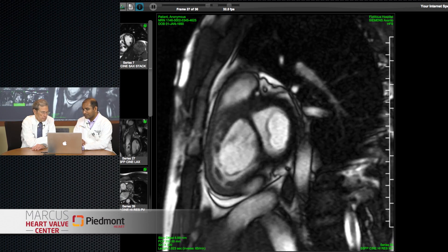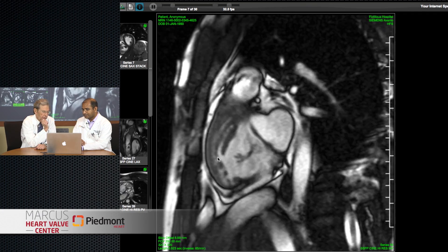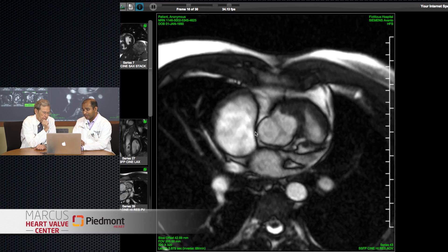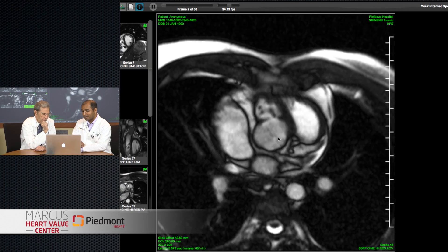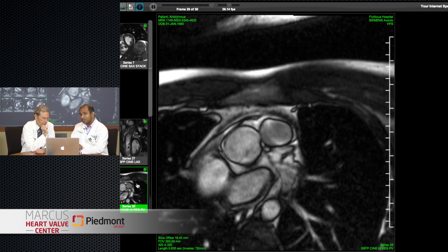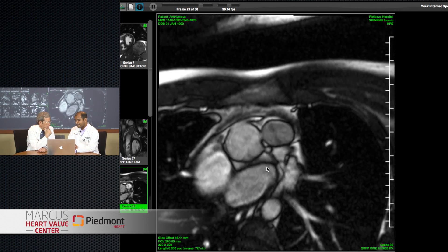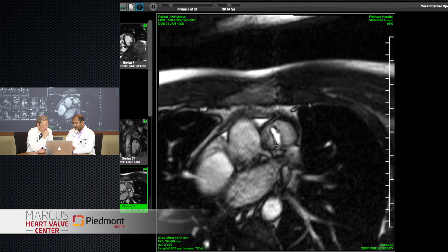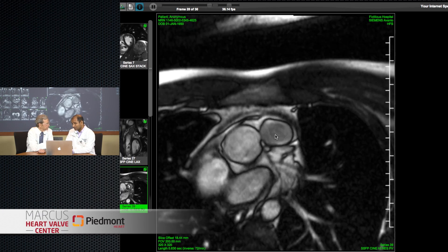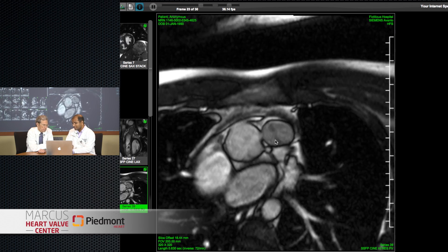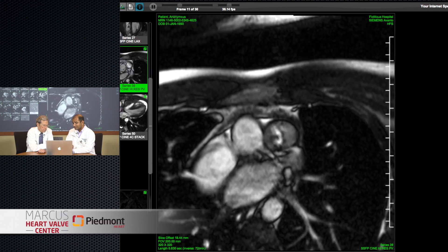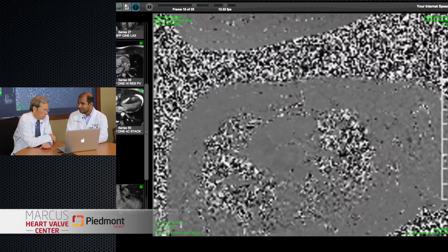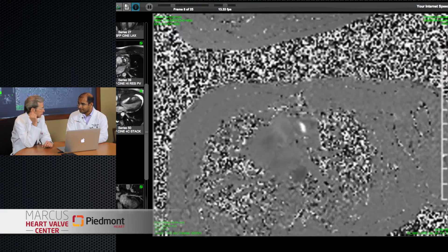You can do high-resolution images of the valves themselves. You can see the tricuspid and mitral valves clearly. The high-resolution image of the aortic valve shows it is bicuspid with a raphe in the left cusp. You can also do a very good high-resolution image of the pulmonic valve — which is also bicuspid and stenotic. The planimetered area of the pulmonic valve in this patient was about 0.6 centimeters squared. The peak flow across it was 4.5 meters per second, comparable to Doppler echo, indicating a very high peak gradient.